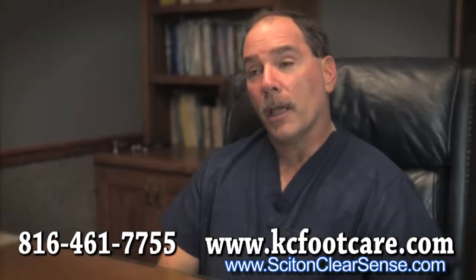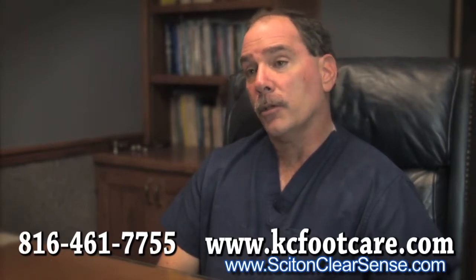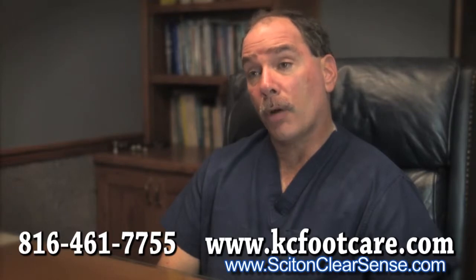One of the questions that I'm asked by patients is how long the treatment takes. I explain to them that generally it takes between 15 to 20 minutes for all 10 nails to be treated properly.